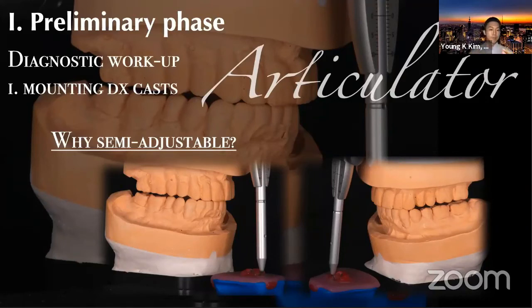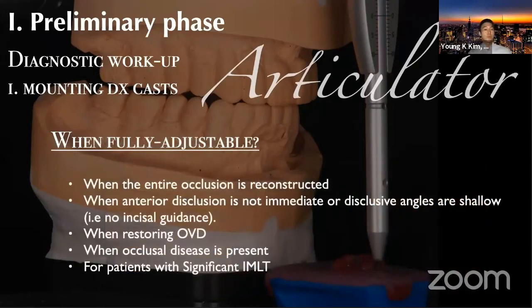If you see on the tip of the articulator over here, you see the red pattern resin. That's the custom incisal guide table, where we establish the mutually protected occlusion through the interim or wax up. We can fabricate the interim incisal guide table so that we can preserve the occlusal anatomy of the dynamic relationship, so that the lab technician later can utilize this for doing the wax up for final processes. So by having this flexibility of adjustments, we can use a semi-adjustable.